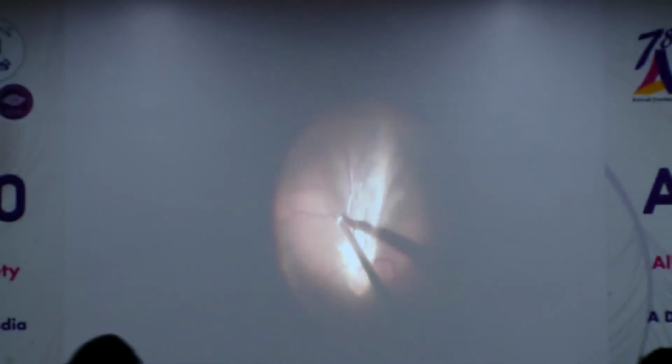A core vitrectomy was performed. In an attempt to open up the falciform fold, triamcinolone acetonide assisted posterior hyaloid removal was done.